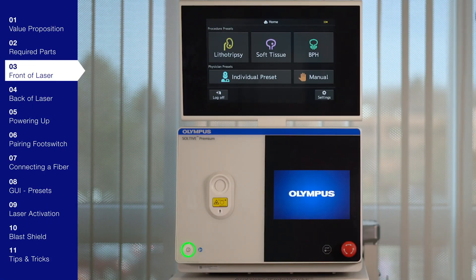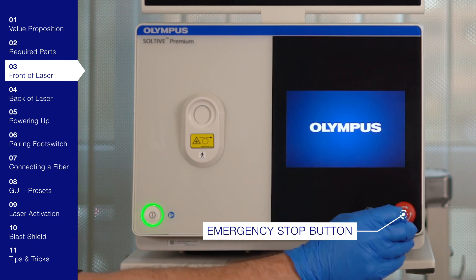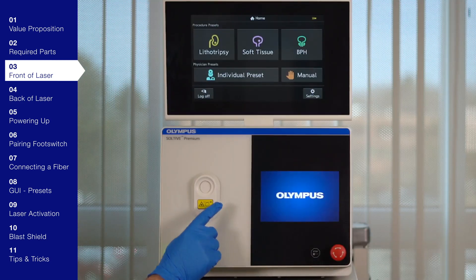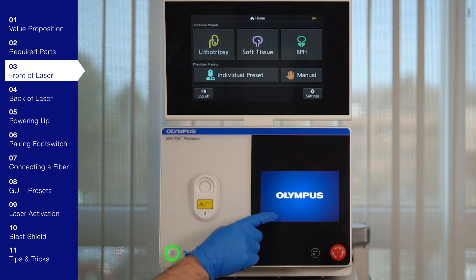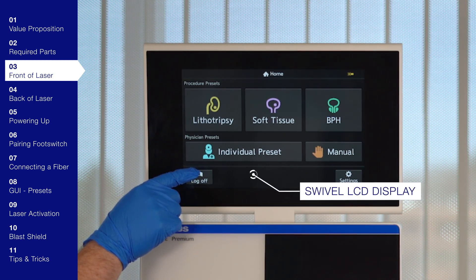We're going to go over the front of the system now. The power switch in the bottom left corner illuminates green when powered on. The red emergency stop button in the bottom right corner — in case of emergency, push it to immediately stop all optical emissions and high voltage generation of the laser. To reset the button, rotate the knob clockwise until it releases into the original position. The laser port has a dust shutter that automatically opens and closes when a surgical laser fiber is inserted and removed. Here's the LCD screen. With the premium, in addition to the LCD display, you'll also get the 12-inch pop-up auxiliary screen with graphical user interface for convenience.